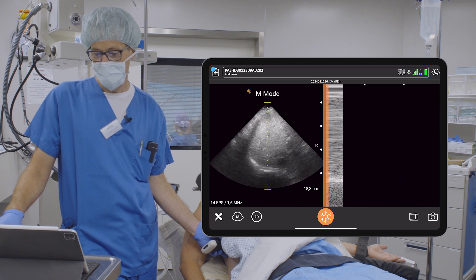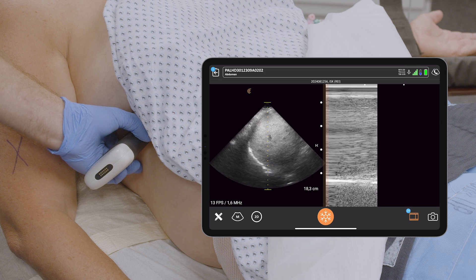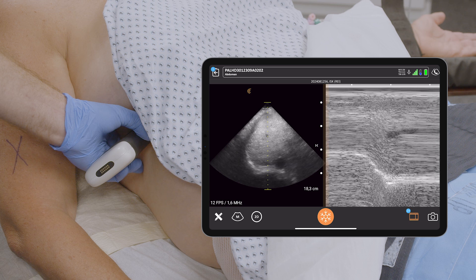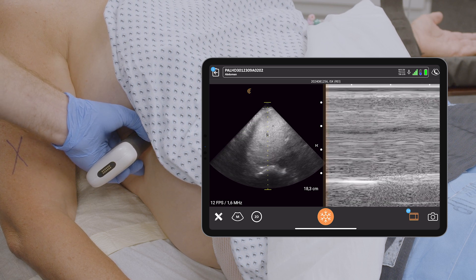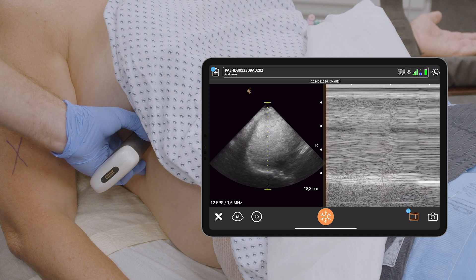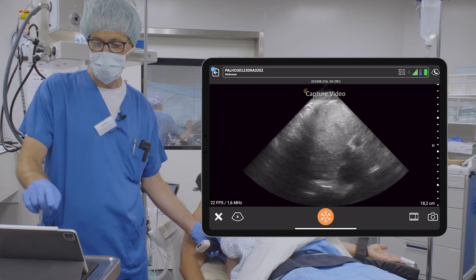M-Mode. Capture video. Jetzt mal richtig tief atmen. Und ausatmen. Very nice diaphragmatic function. That's all to tell us that, as expected, the diaphragm works totally in a normal way. B-Mode. Excellent. Capture video will stop the video.